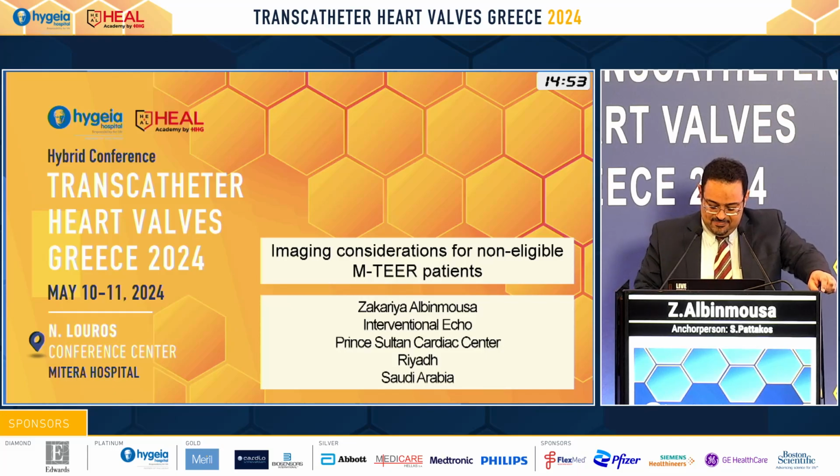So I'm going to shed some light on some difficult, non-eligible, or non-favorable cases for mitral TEER, and we'll go over one case at the end to show how to deal with such patients.